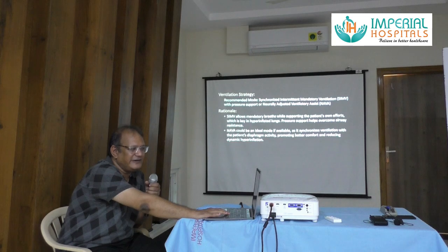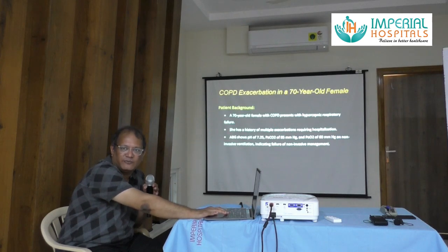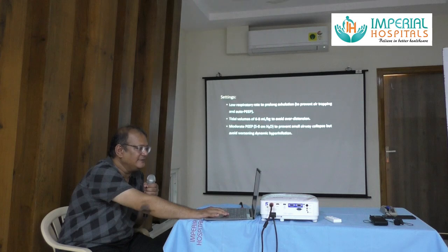Again, neurally adjusted ventilator assist is not available for us, so we'll not discuss that. So a patient with COPD exacerbation, the mode will usually be SIMV, right? The advantages of SIMV are that mandatory breaths are guaranteed and patient efforts will be allowed. This is useful in hyperinflated lungs. An exacerbation COPD patient will have hyperinflated lungs, right? Pressure support helps overcome airway resistance.